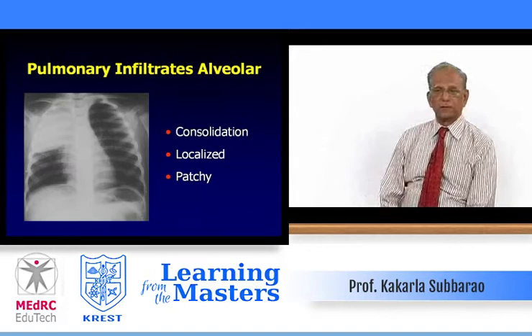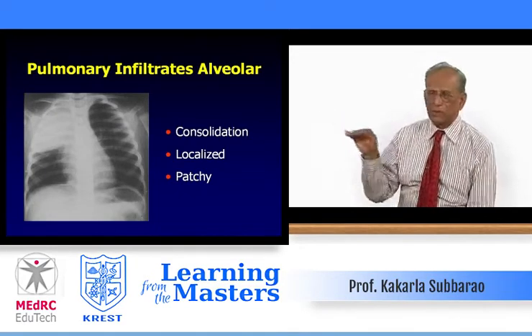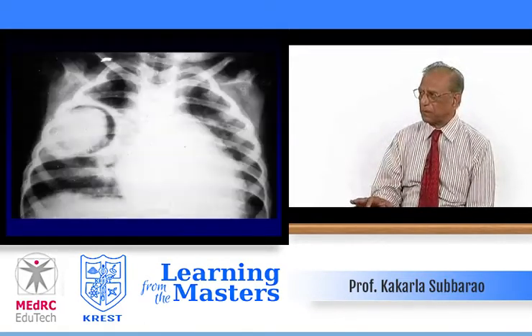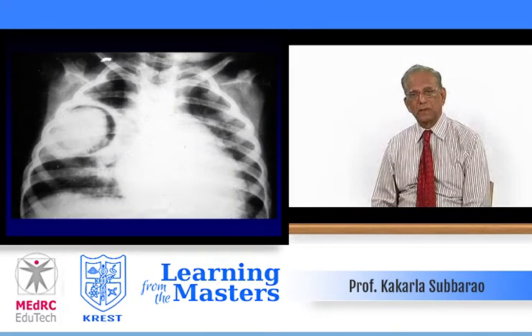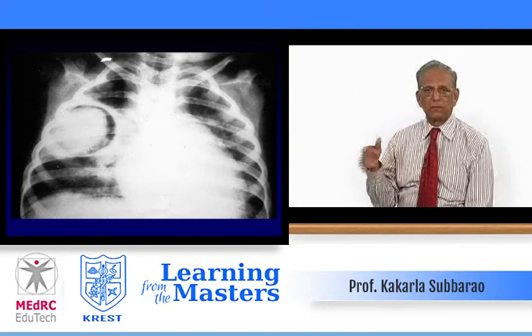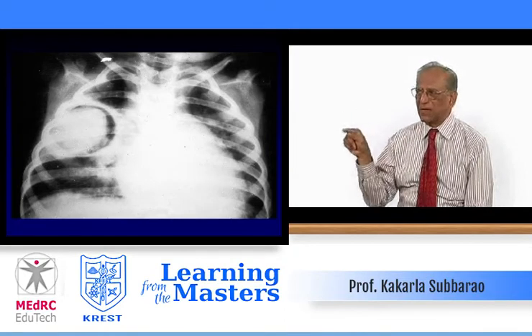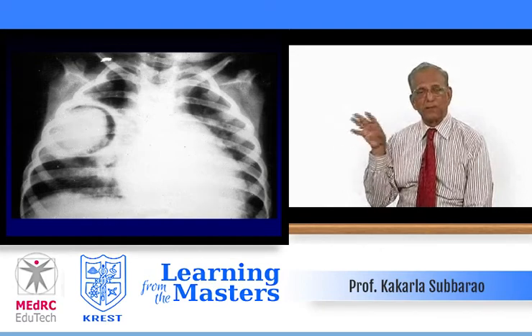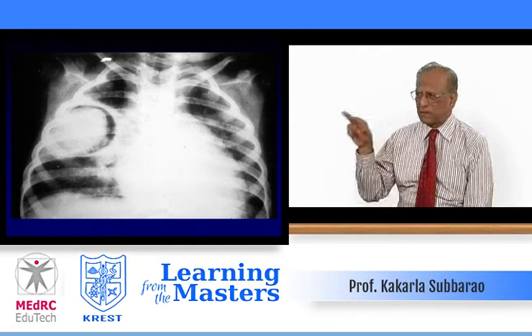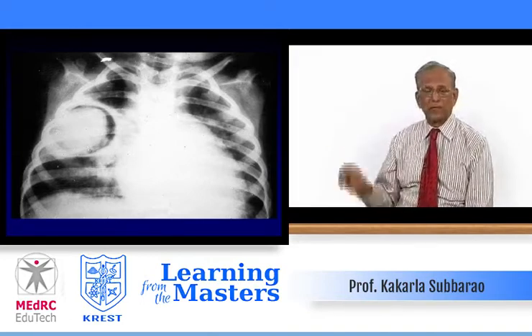Consolidation — particularly in bacterial pneumonias — may be located in only one lobe. Look at the right upper lobe consolidation limited by the transverse fissure: localized patchy consolidation, bacterial pneumonia. In another case, pneumonia that had cavitated by the time the patient presented — look at that meniscus-type sign: lung abscess. This type of pneumonia is generally due to staphylococcal infection. Pneumococcal pneumonia does not present like this; staphylococcal or Pseudomonas pneumonia can present with an abscess.